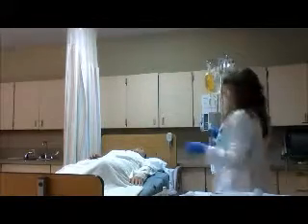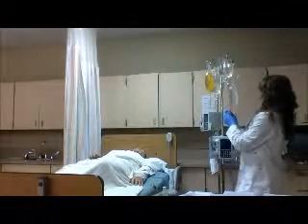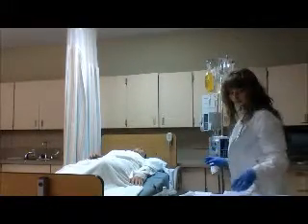So I'm going to take an alcohol swab and swab that off. I'm going to unclamp this. Alright.